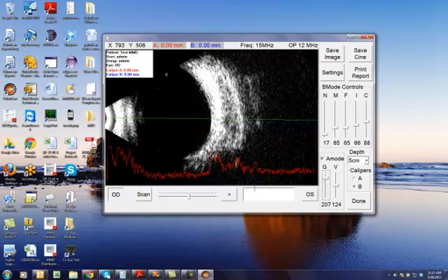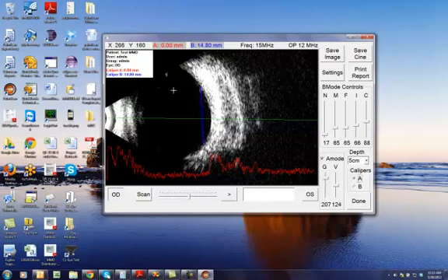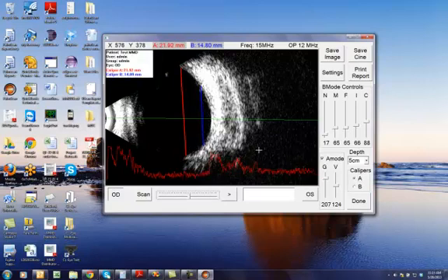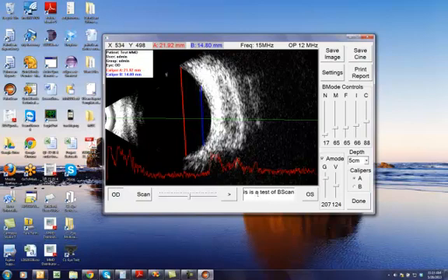And you can also place cursors again as usual. And let's make this measurement just for an example here. You can place some text about your findings. This is a test of B scan.